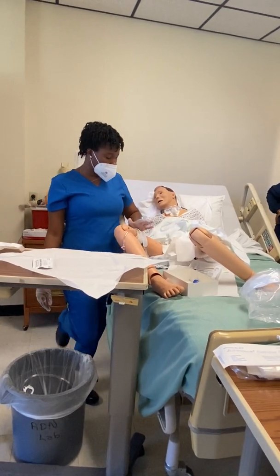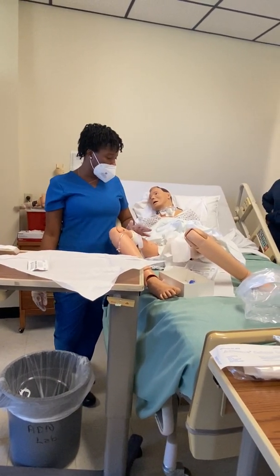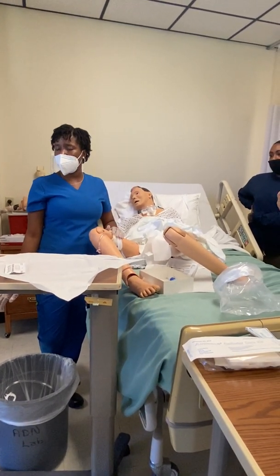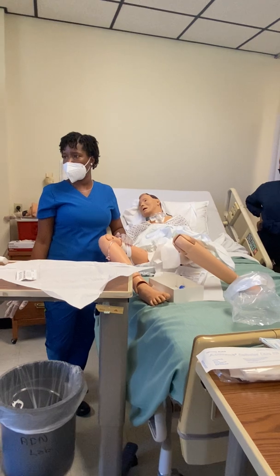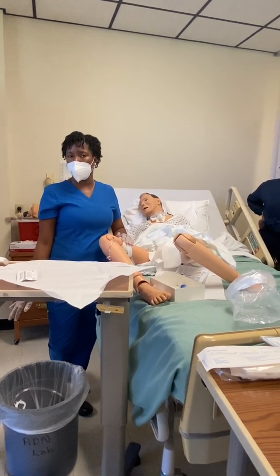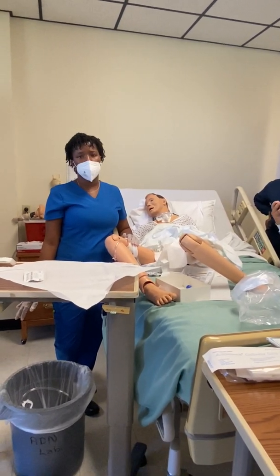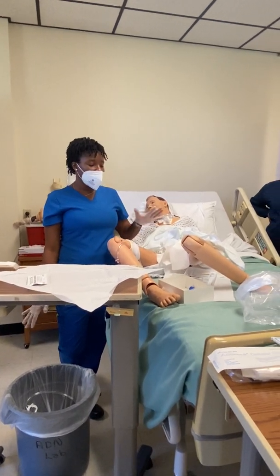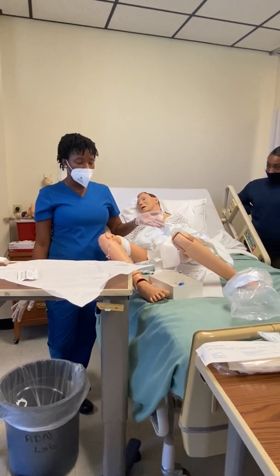Now, what are we going to do if, okay, we got the catheter in, now you have to take it out. So what do you think we're going to do? You have to deflate the bulb. Deflate the bulb, that's right. So of course I got everything handy here right now so I can just deflate it.